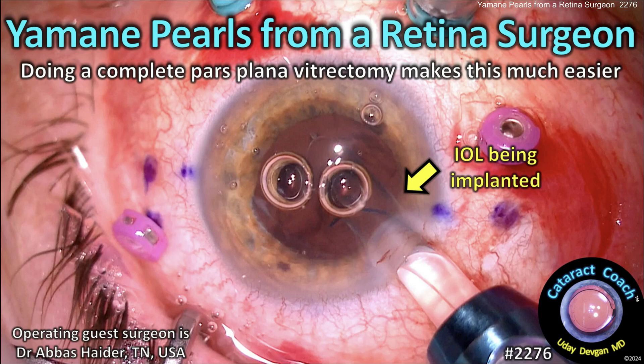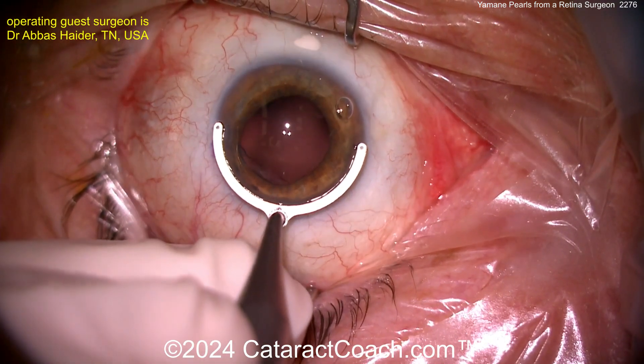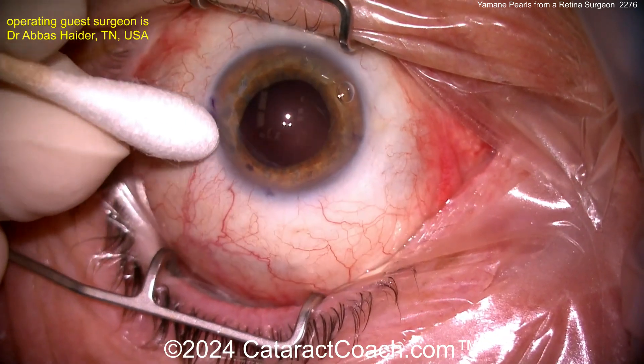CataractCoach.com — Yamane pearls from a retina surgeon. Doing a complete pars plana vitrectomy makes this surgery much easier. Now we can see the beginning of the case: the patient is being marked here with a 180-degree marker, so you get the lens evenly positioned there.